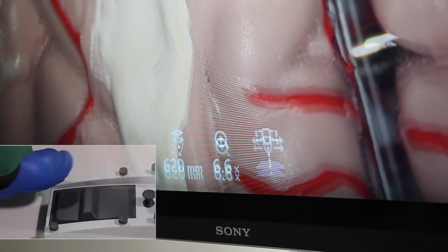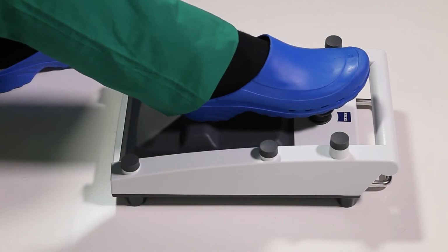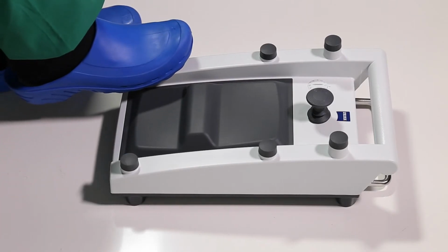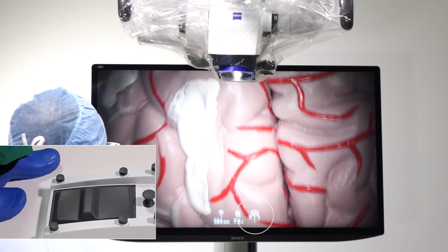Using the configured lower left button, select the XY microscope mode. Use the foot control joystick to control the movement. Press the same button to activate XY stand mode. Pressing the same button again will activate point lock movement.